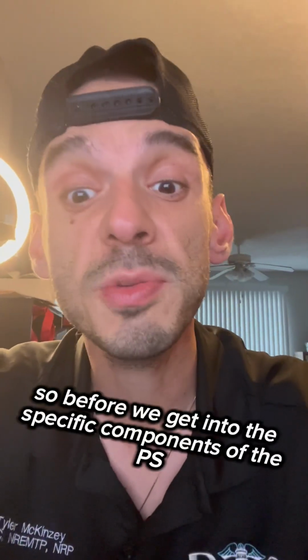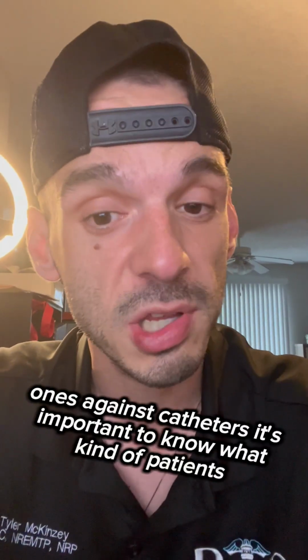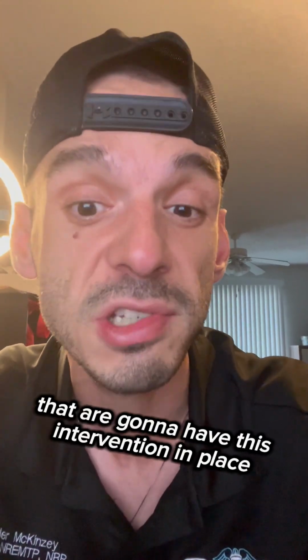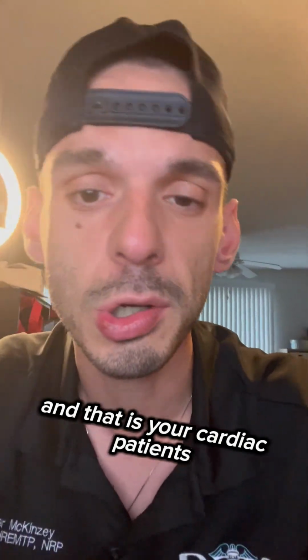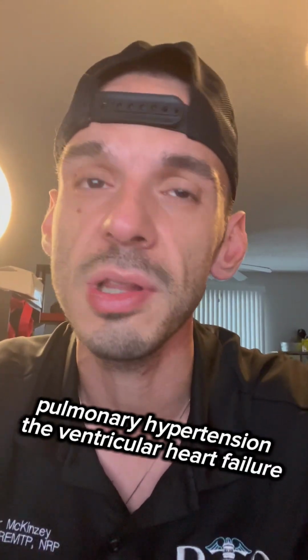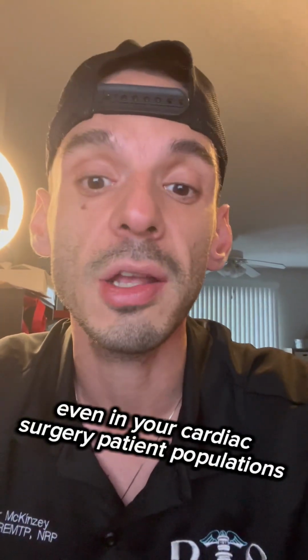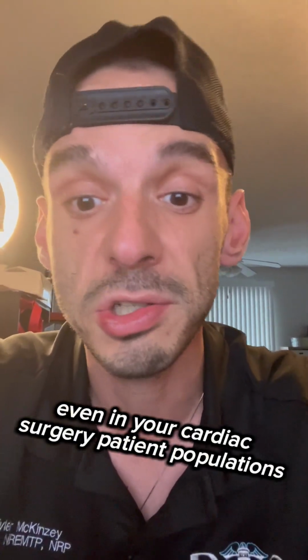Before we get into the specific components of the PA Swan-Ganz catheter, it's important to know what kind of patients you're likely to run across that are going to have this intervention in place. And that is your cardiac patients, pulmonary hypertension, left ventricular heart failure, even in your cardiac surgery patient populations.